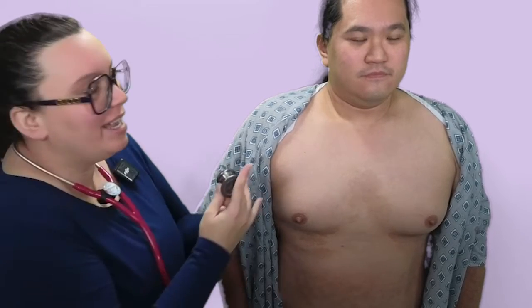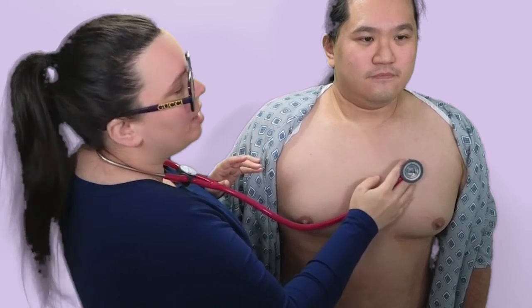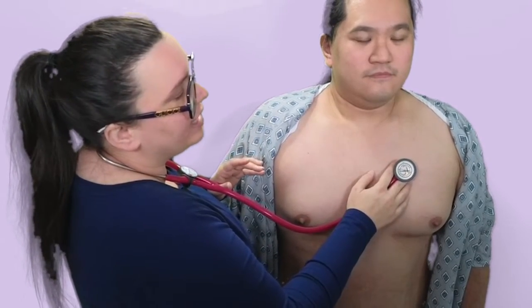Following this entire assessment, we're going to switch our stethoscope to the bell and listen to all of those points again. In this part of the assessment, we want to focus on detecting heart murmurs by listening for any swishing, blowing, or other abnormal sounds that we wouldn't expect on a normal assessment.